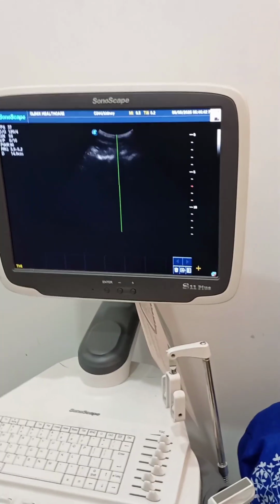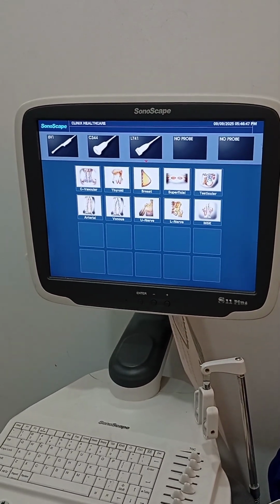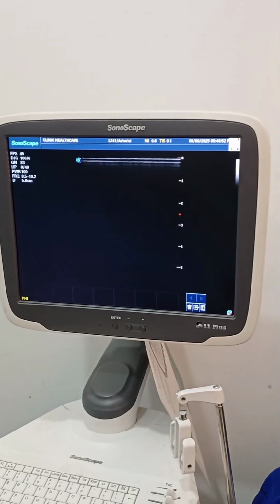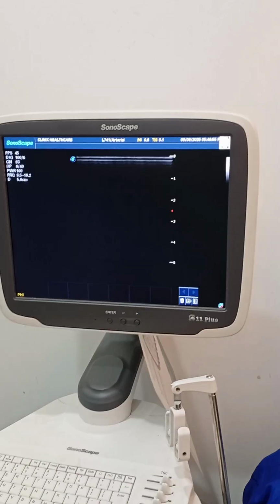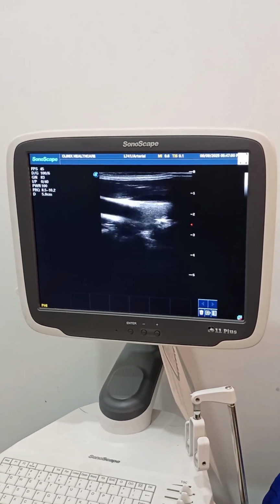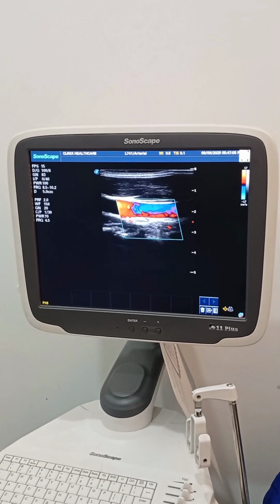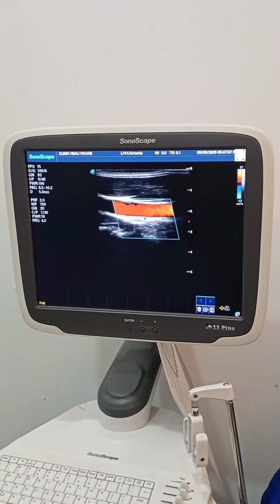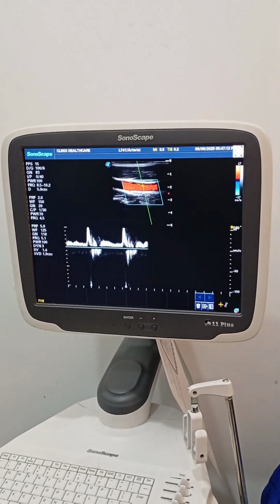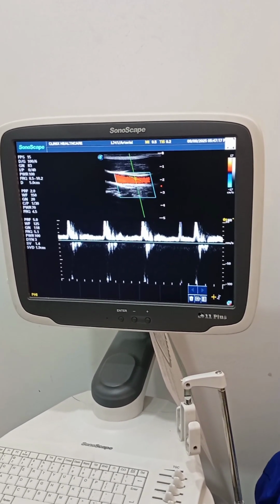For instance, you want to look at how blood flows in an artery. For instance, you are going to go to the carotid artery. You use your surface probe, the linear probe, and go to get the vessel. You first of all use your color Doppler. You can see the color moving. Then you use pulse wave Doppler to measure the spectrum. This is the triphasic form, meaning you are in the external carotid artery.